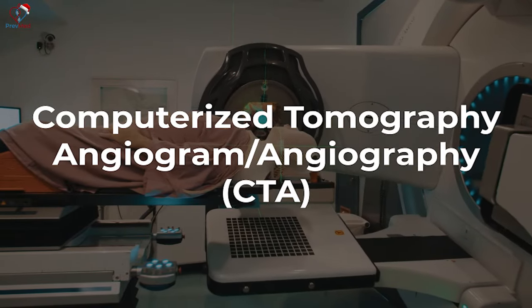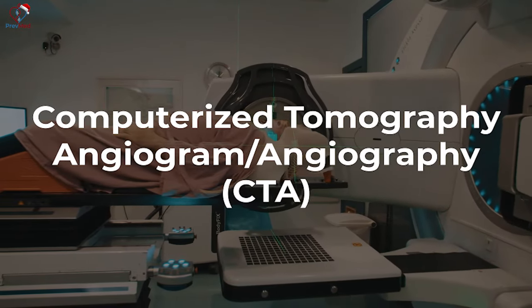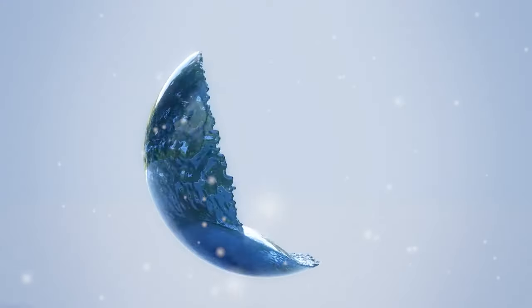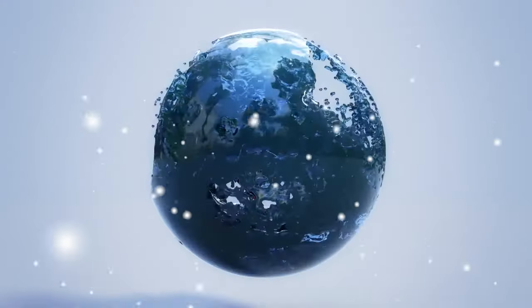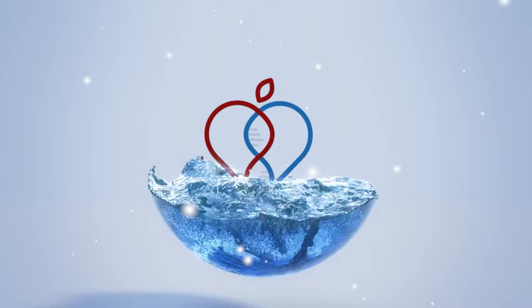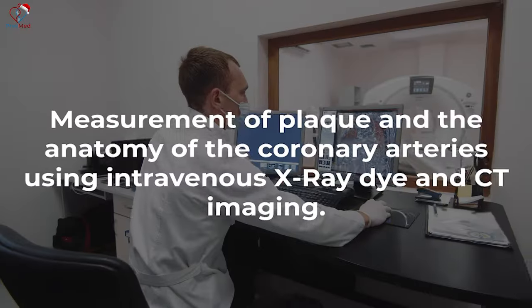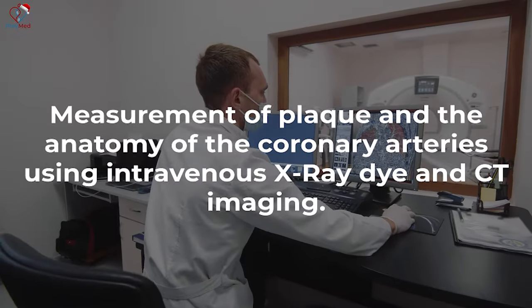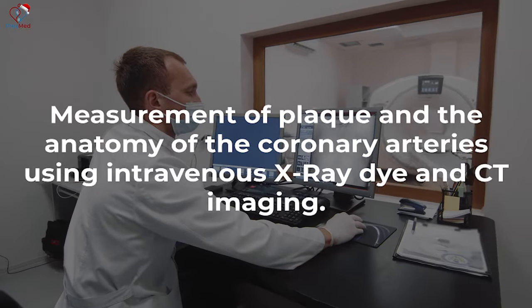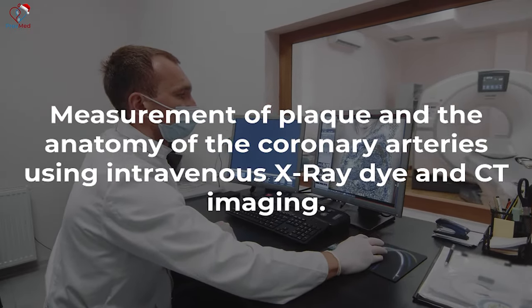CT angiogram — what does it stand for? Computerized tomography angiography, or angiogram. It's a measurement of plaque and the anatomy of the coronary arteries using intravenous x-ray dye and CT imaging.